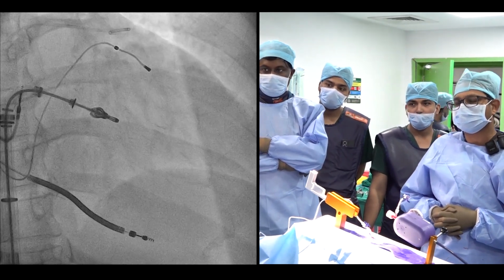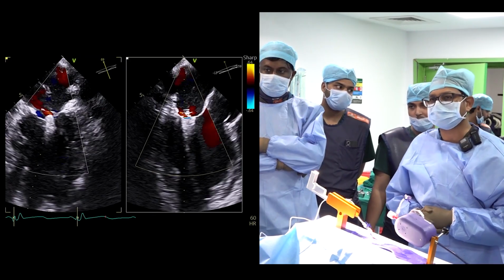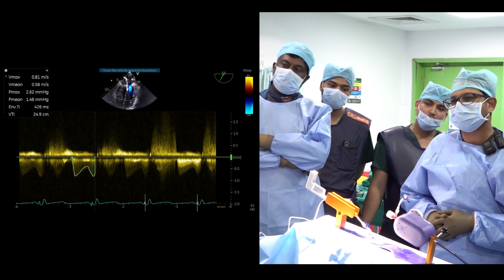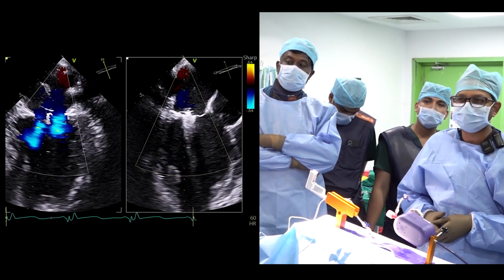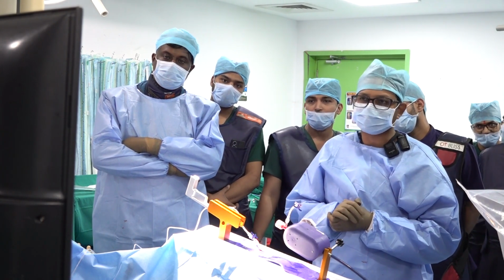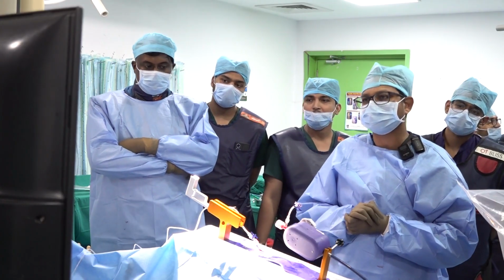With the MyClip grasper down, we simultaneously assess the parameters on the echocardiogram, to see that our grippers are in a good position and we are bisecting the jet of mitral regurgitation. The mean gradient is 1.48, which means we didn't create any significant mitral stenosis because it is almost like before the procedure. We have seen there is a minimal jet. We have also seen the pulmonary venous flow; before the MyClip the flow was blunted, but here there is only systolic flow.